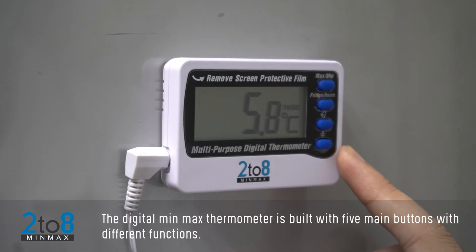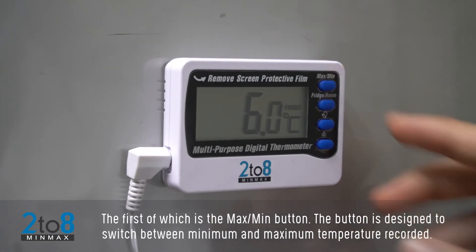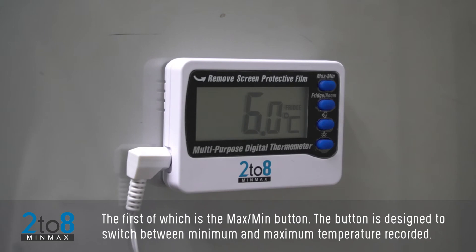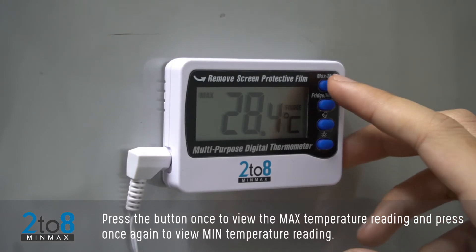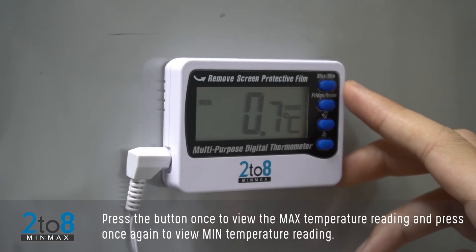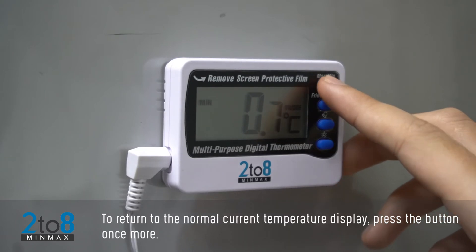The digital min-max thermometer is built with five main buttons with different functions. The first is the Max/Min button, designed to switch between minimum and maximum temperature recorded. Press the button once to view the max temperature reading, press once again to view the min temperature reading, and press once more to return to the normal current temperature display.